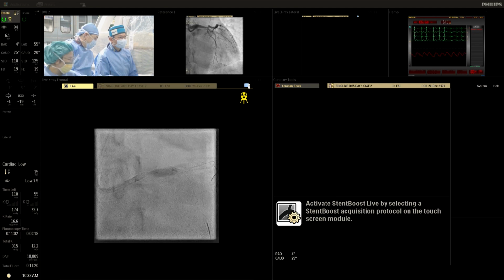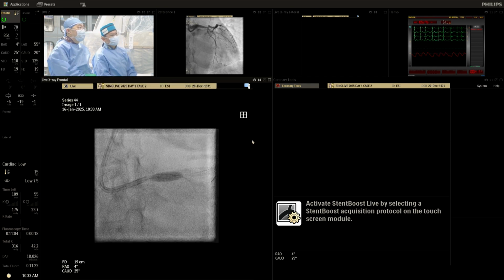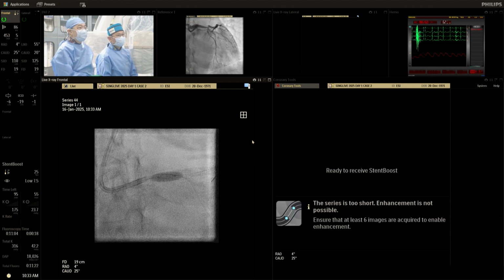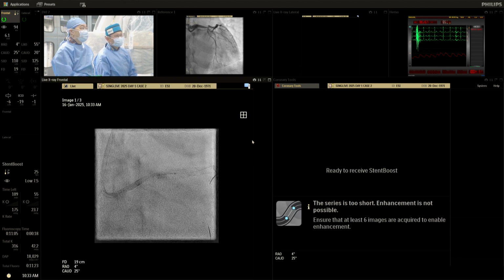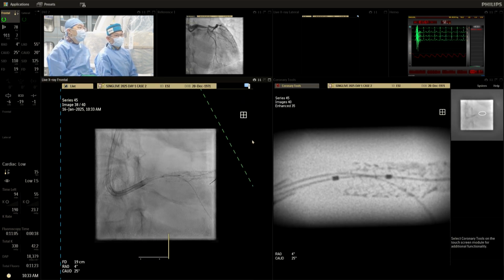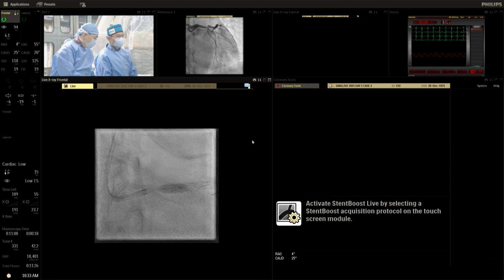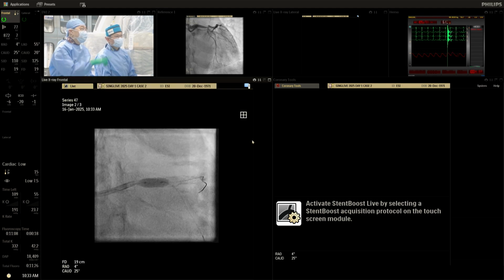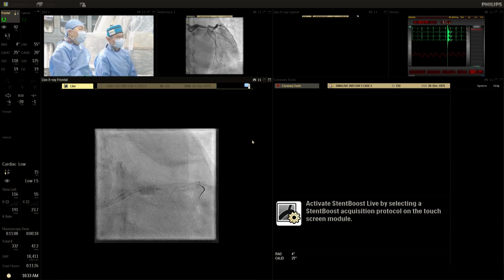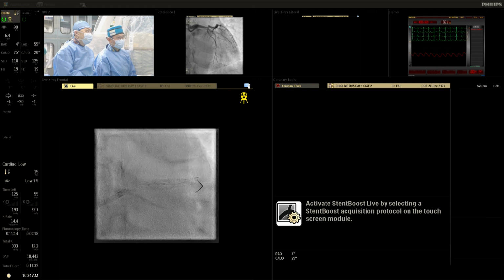This is 8, 10, 12. Okay, boost again. Yeah, much better now. Looks better on the stand boost. Okay, one more time. And then we go in a little bit. 12. Inside, yeah. And then we're going to repeat the OCT.